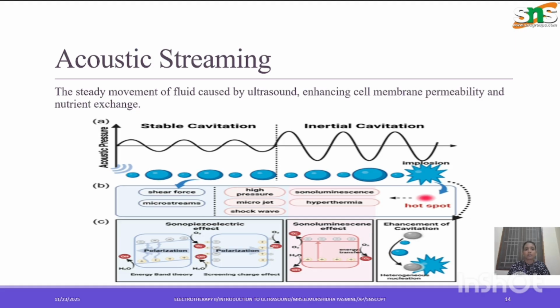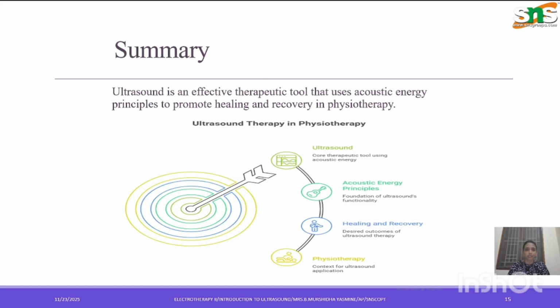Acoustic streaming is the steady movement of fluid caused by ultrasound, enhancing cell membrane permeability and nutrient exchange, in therapeutic ultrasound.